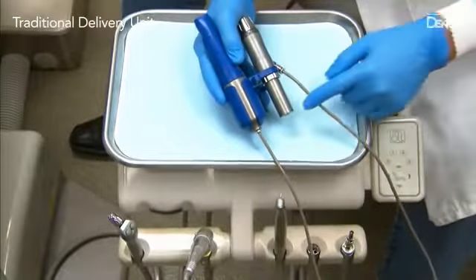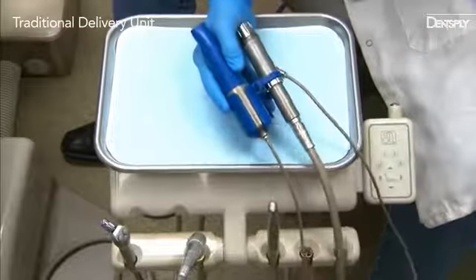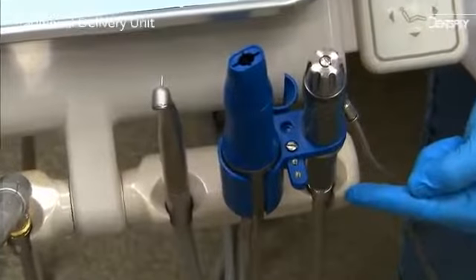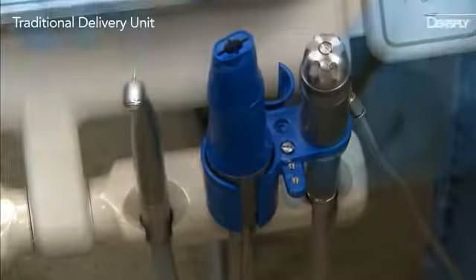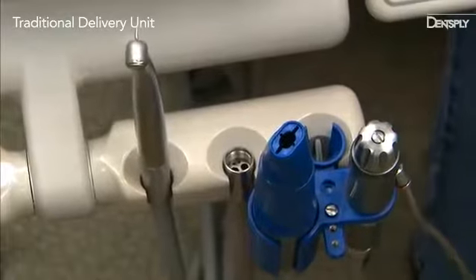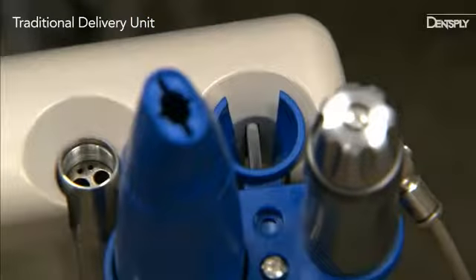Connect the dental hose to the regulator. The regulator can be connected to an ISO threaded connector or a quick connect coupler. Place the assembly on the dental delivery unit by placing the hose and regulator in the tool holder — this is the off position. When ready to use, lift the regulator out of the tool holder and place the adapter post into the tool holder. The slot in the adapter post will activate the air switch and allow dispensing to be controlled by the foot pedal.